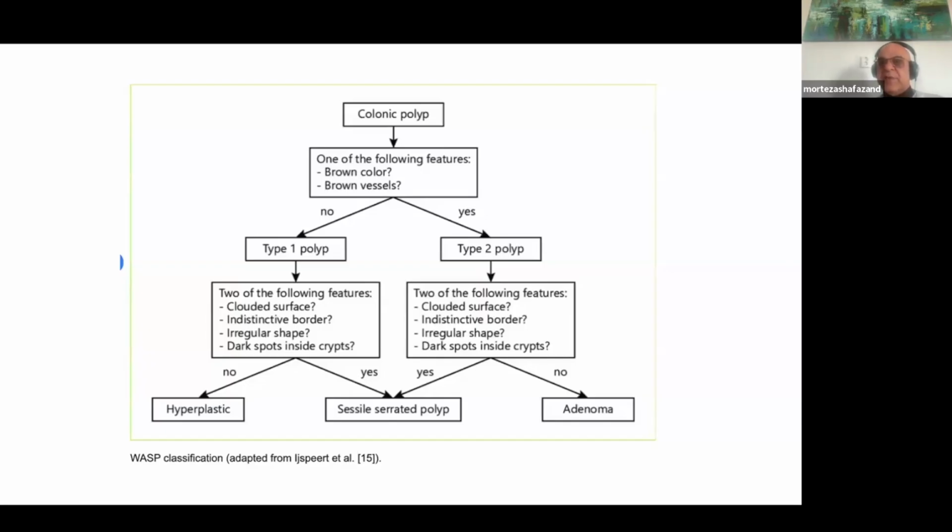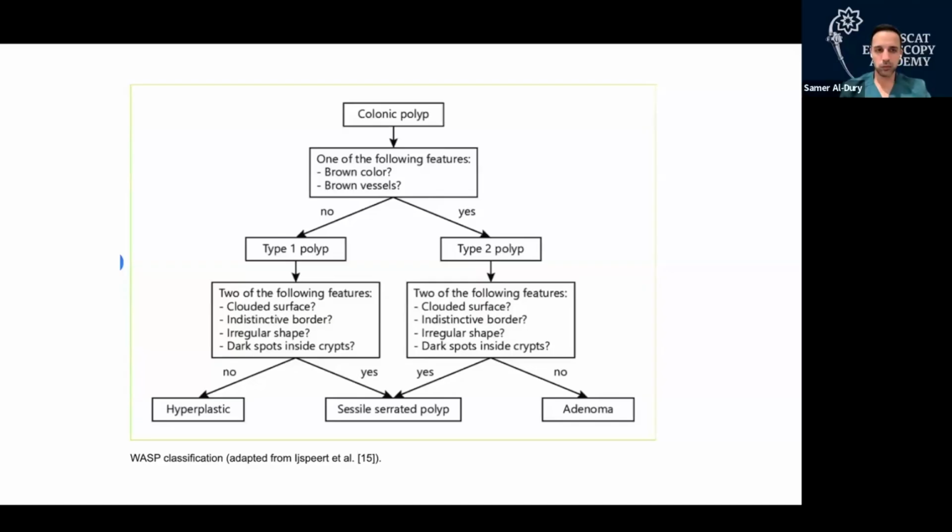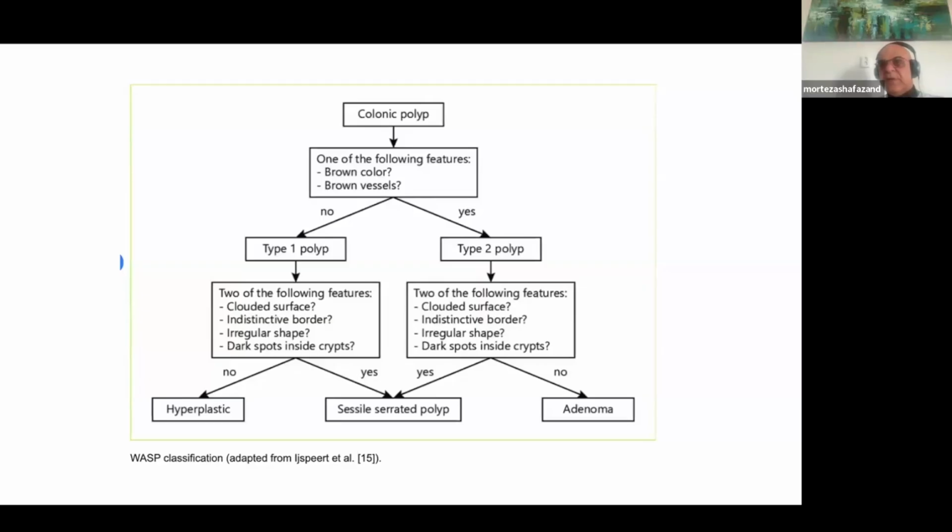That's why the recommendation of double checking the colon is in all kinds of guidelines, to make sure that you have seen the colon properly. So for the right colon, if I want to have at least 10 minutes for my withdrawal time, I always put 2 extra minutes for the right colon.